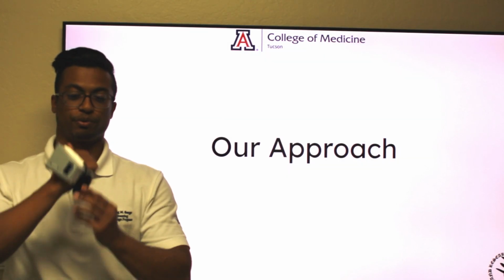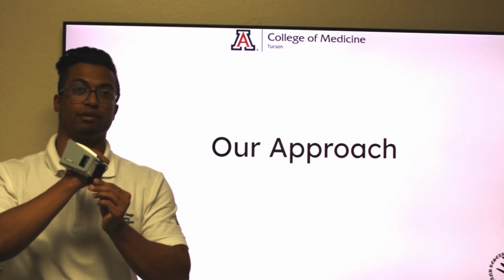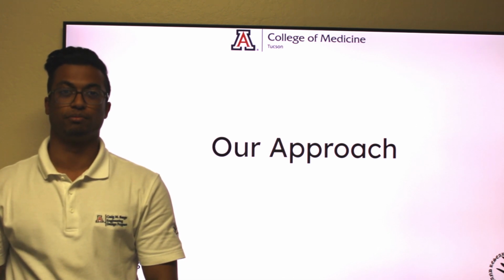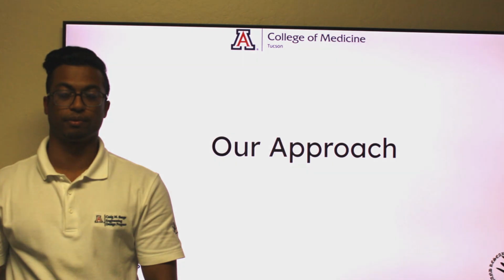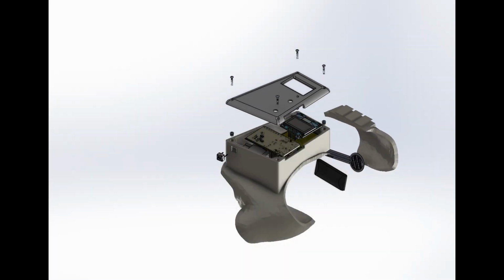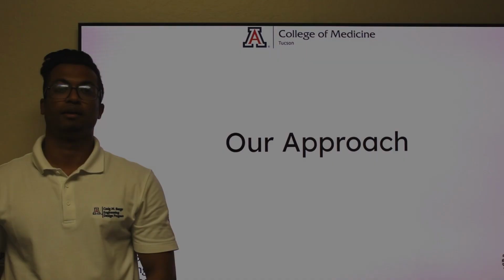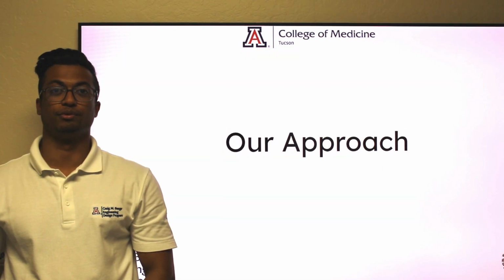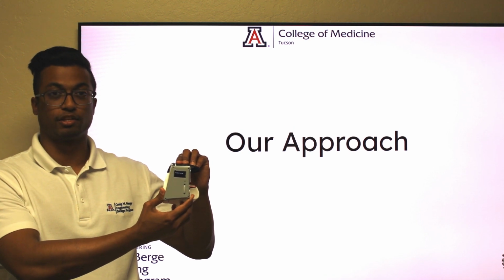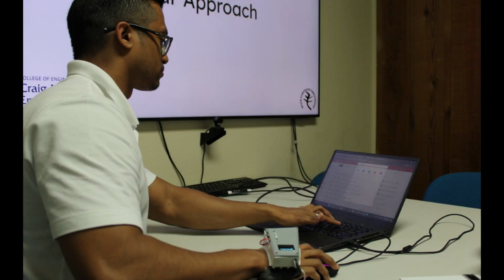Our device, NumaBrace, is a 3D printed multi-material brace that combines pneumatics and electronics onto a single rechargeable system to provide radial ulnar wrist compression therapy. A rubber bladder sits inside the brace to cyclically inflate and deflate, while a force sensor allows the device to regulate the amount of force placed on the user's hand. In contrast to the manual device used in Dr. Li's research, NumaBrace offers an automated therapeutic experience designed to seamlessly fit into a user's life without disruption.